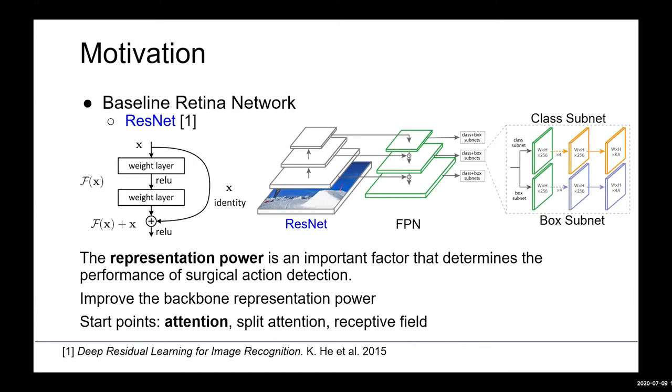To this backbone, RetinaNet attached 2 subnetworks, one for classifying anchor boxes and one for regressing from anchor boxes to ground truth object boxes. This design can reduce the accuracy gap between our one-stage detector and the state-of-the-art two-stage detectors.